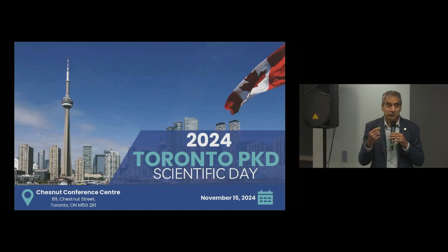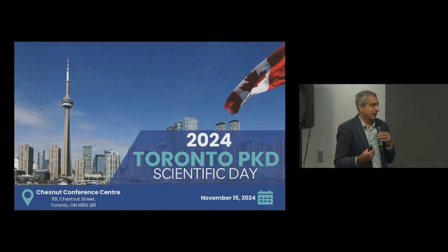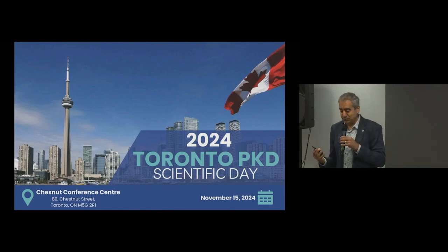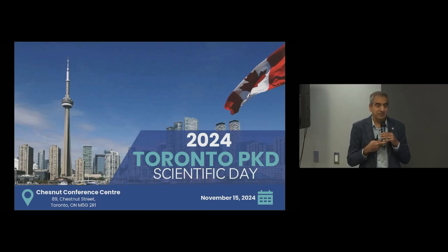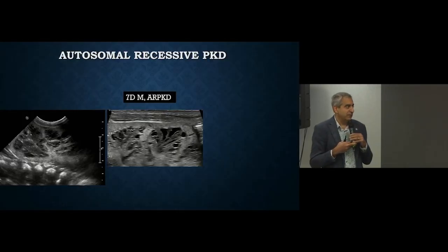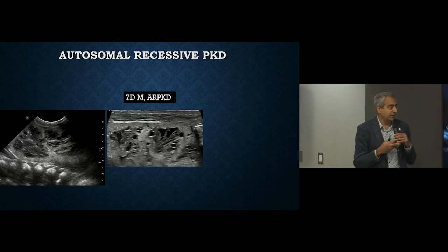Those of you who do research and those of you who are involved with renal transplantation, where ultrasound can get fairly close to the kidney transplant, can see the degree of detail is incredible. Very often we're seeing sub-millimeter abnormalities as well.